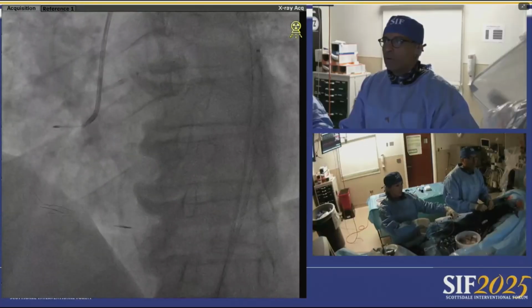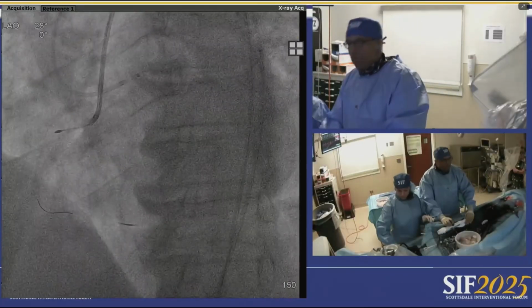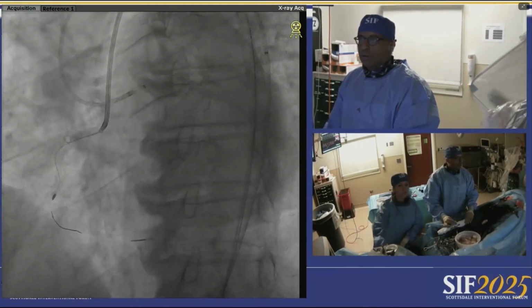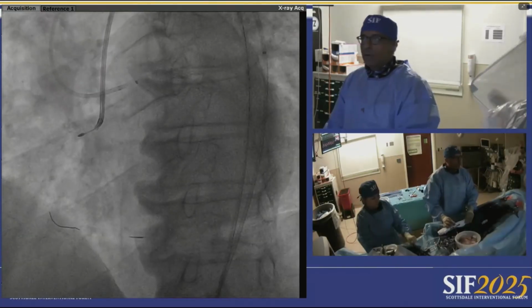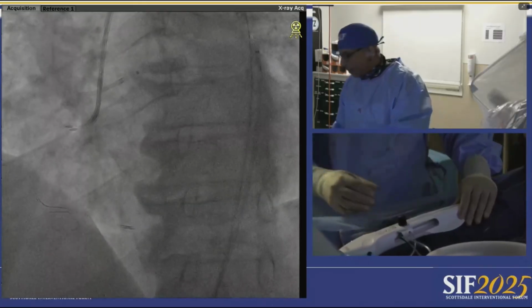It's also not something that you're probably going to get down in this particular distal right. If you had to do reverse CART really far down past the mid-vessel, this is probably not the vessel for a Liquid that far down. It's going to be great if you just need to get into the proximal vessel with support and everything else, but as with everything, there are pros and cons.